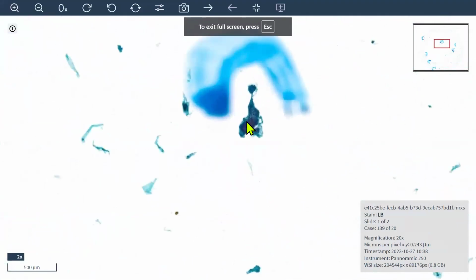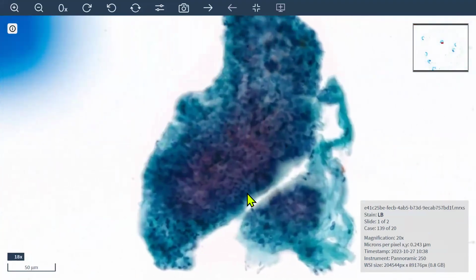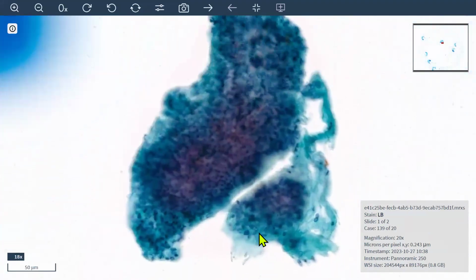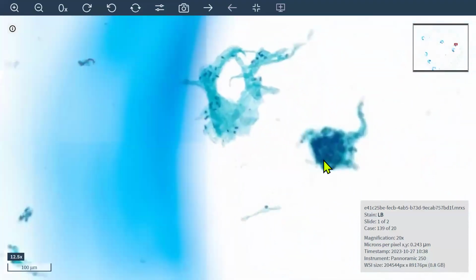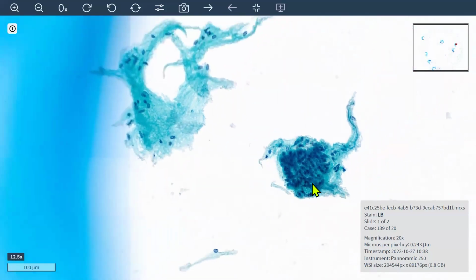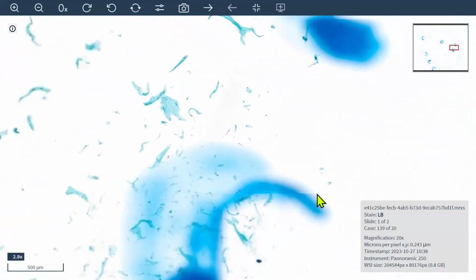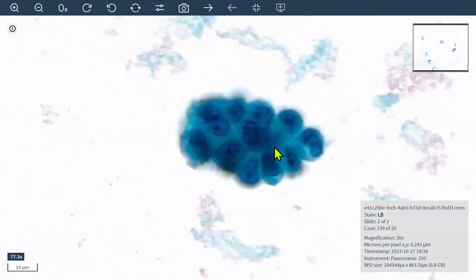Okay, so this is a case of bile duct brushing. Okay. Cytoslides are a little difficult to scan if you have seen scan slides, because they have this 3D behavior. It's quite difficult. Anybody wants to suggest what is the diagnosis? If you see like this in a peritoneal or pleural sample, what will you give the diagnosis as? Please answer. It doesn't matter even if you're wrong. I just want the answer.